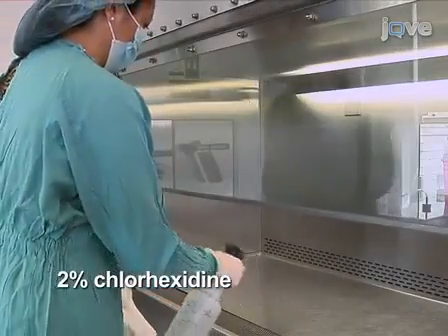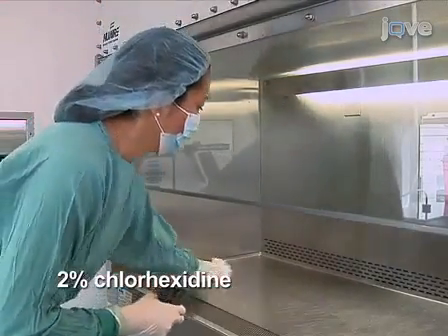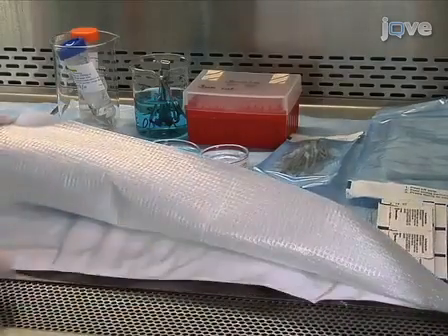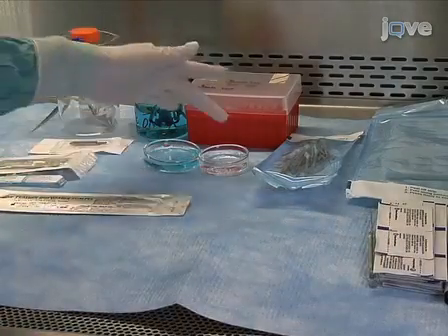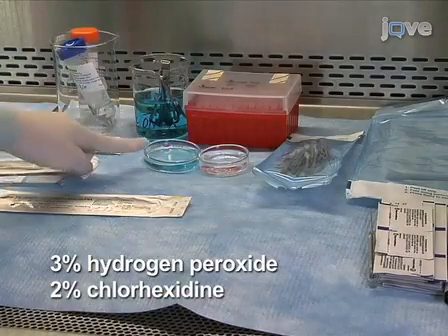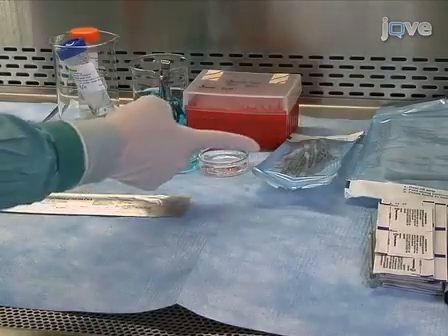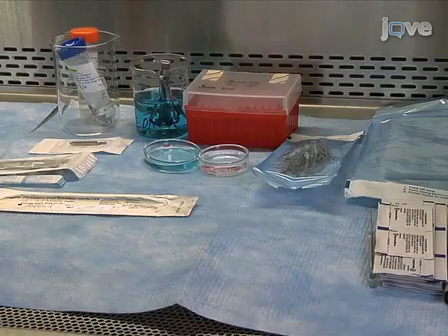Disinfect the surgical area by spraying all surfaces with 2% chlorhexidine. Next, place the following supplies in the surgical area: a heating pad to maintain mouse body temperature, 2 small petri dishes, one containing 3% hydrogen peroxide and one containing 2% chlorhexidine, sterile gauze and cotton swabs, sterile disposable scalpels, and an autoclave surgical stapler.